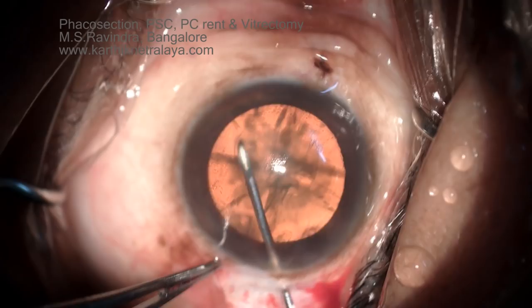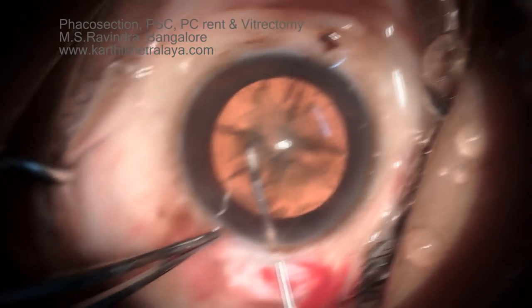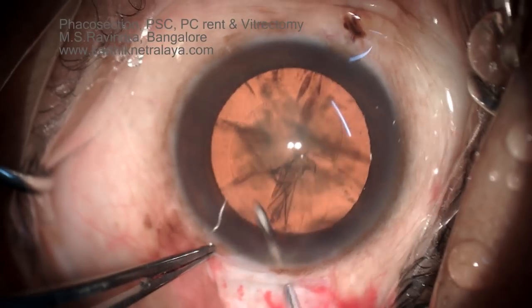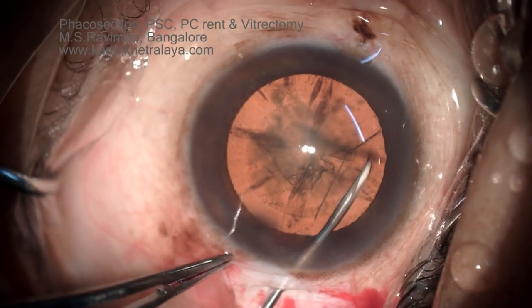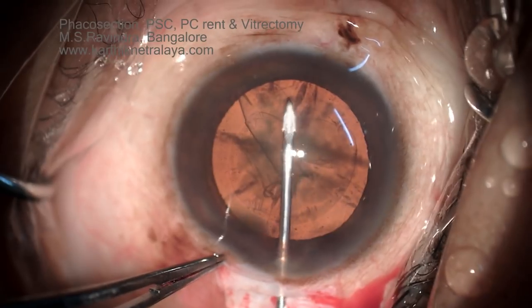The rhexis is of adequate size, approximately 5.5 mm. Hydrodissection is attempted at the end of the rhexis after completing the internal opening of the tunnel.